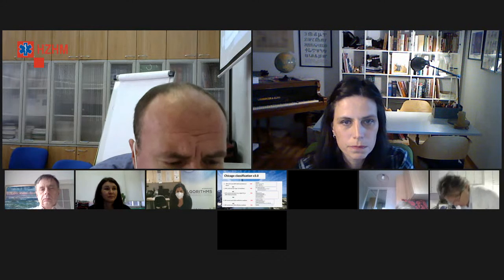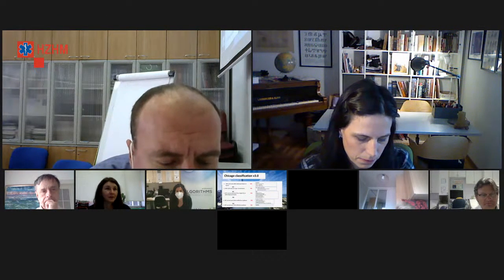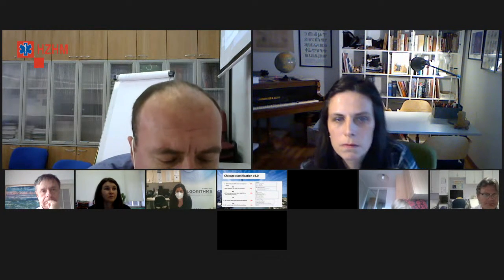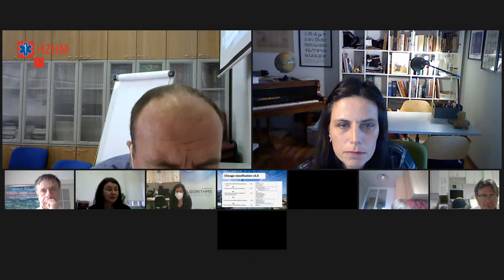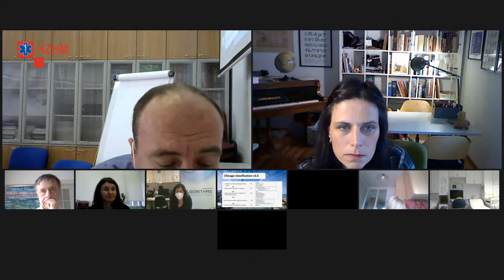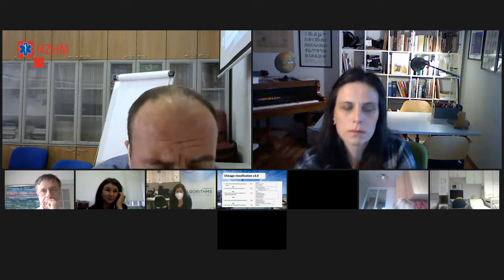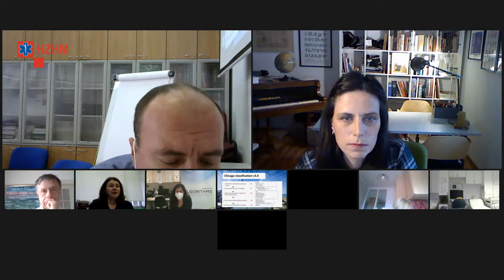Najčešći uzrok rađenja je ahalazija, a onda neke teže gastroezofagealne refluksne tegobe i hijatalne hernije, koje nam kolege digestivci šalju kada nije jasno nakon gastroskopije i pasaže. To su za sada najčešće indikacije za gornju manometriju kod nas. Otprilike jedna tjedno, jedna u 10 dana se izvodi.